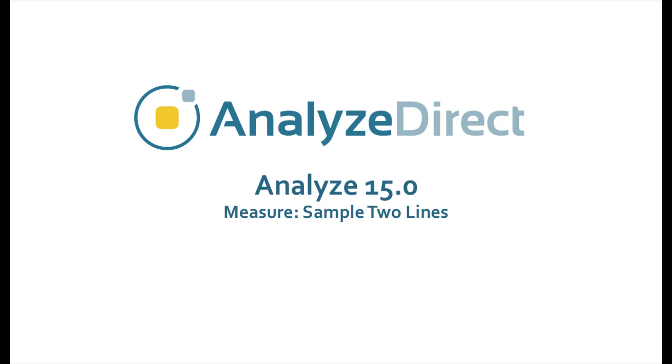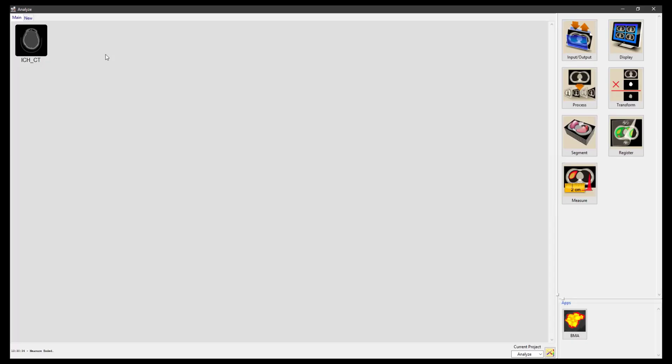The Sample Two Lines tool in Analyze provides an interactive tool for making point, distance, and angle measurements. In this video, we will make measurements using Sample Two Lines on a head CT dataset.